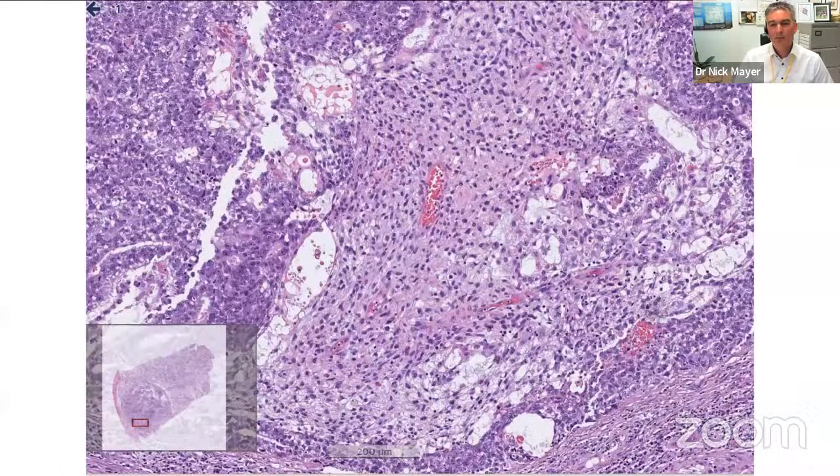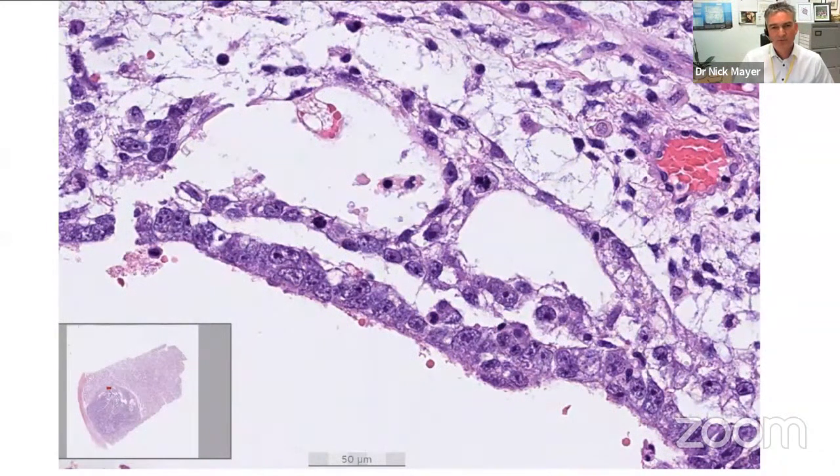But there were other components to this tumor as well. There's an area here which is a bit microcystic or reticulated, and in the central area here a bit more solid, which is not as pleomorphic as the tumor on the left, which would do morphologically for some yolk sac tumor. This was my attempt to find an embryoid body.